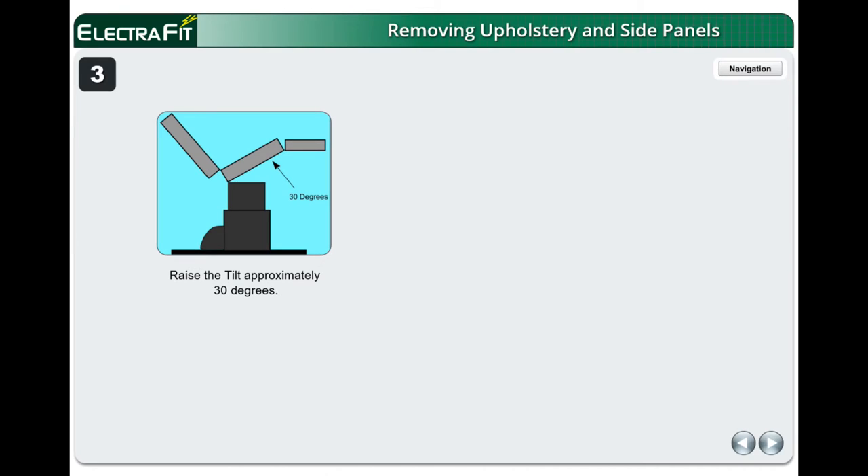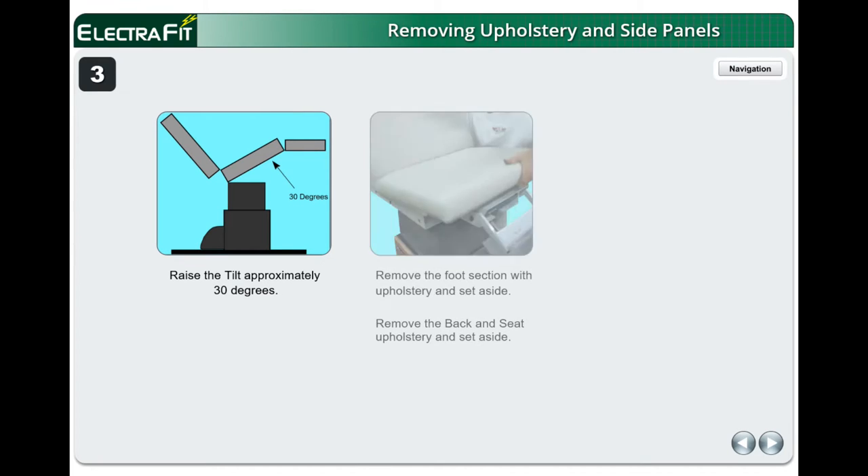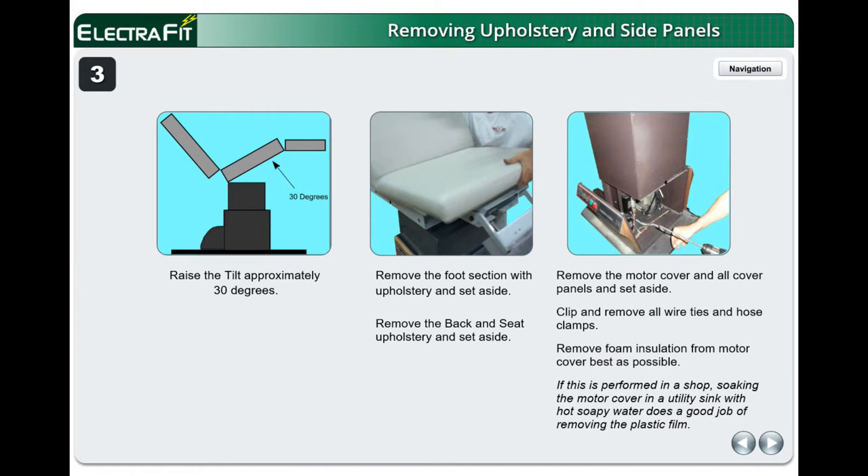Raise the tilt approximately 30 degrees. Remove the foot section with upholstery and set aside. Remove the back and seat upholstery and set aside. Remove the motor cover and all cover panels and set aside. Clip and remove all wire ties and hose clamps. Remove foam insulation from the motor cover as best as possible. If performed in a shop, soaking the motor cover in a utility sink with hot soapy water does a good job of removing the plastic film.